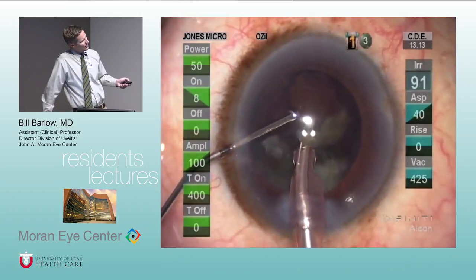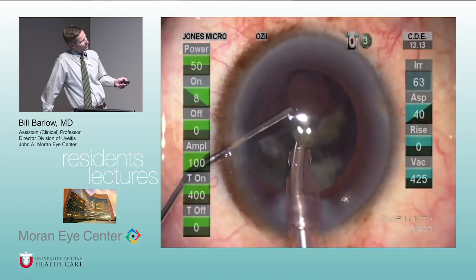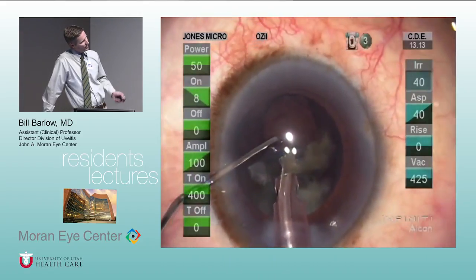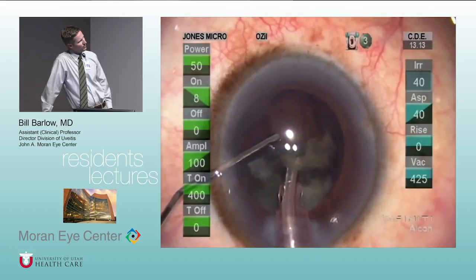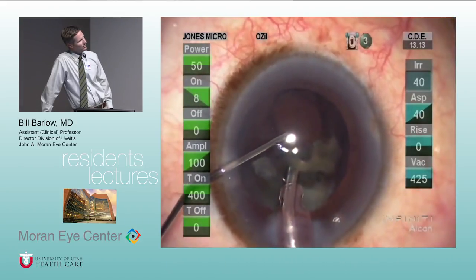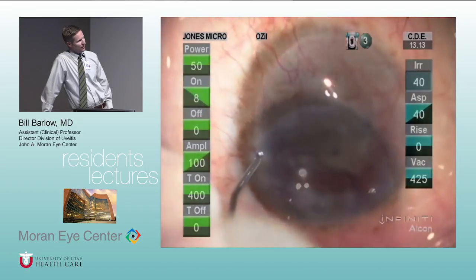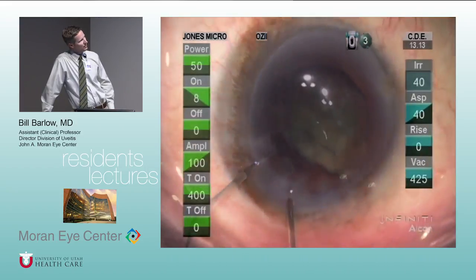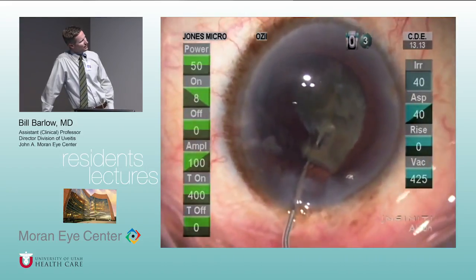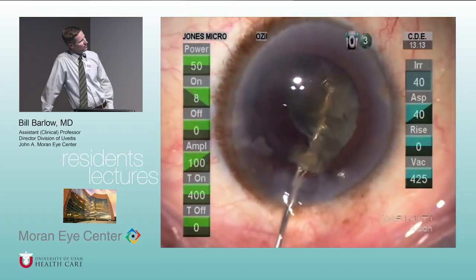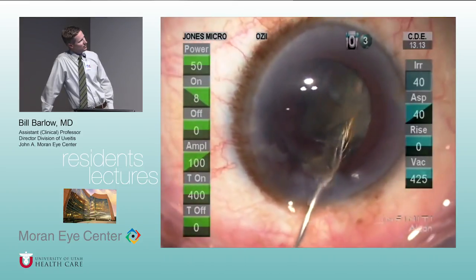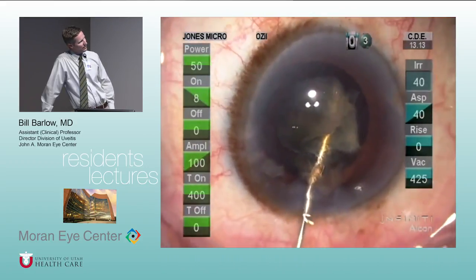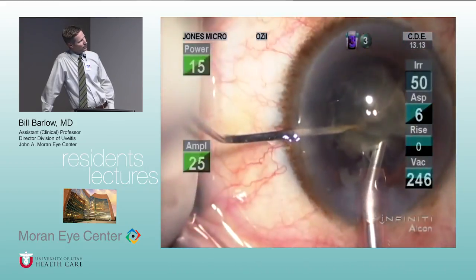He's kept his instrument in the wound. You can see he's got a cannula in the eye and is placing viscoelastic to tamponade the vitreous from coming through the posterior capsular break. He still has some lens material. He's going to compartmentalize that within the anterior chamber. Now that he's stabilized the pressure gradient, he can come out with the main incision and inject additional viscoelastic to compartmentalize the lens material.